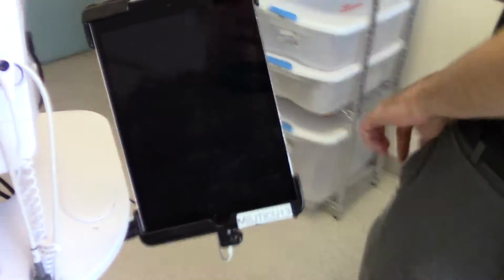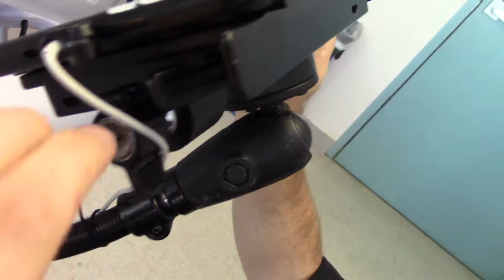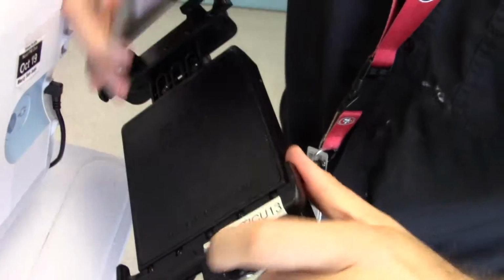Now, while we're up here, do you want to show us how you lock and unlock the frame? Yeah, let me see if I have my key with me. I should have thought to bring that. Oh, no, I got it here. We're good. Yeah, if you dive down under here, actually, we can just rotate it up. Oh, great. Perfect. And you can see here, it's just a little lock and key. And then it pops out. The iPad charge cable feeds through the bottom here.